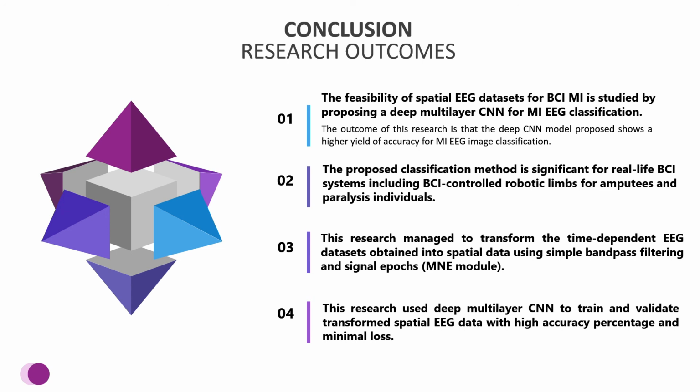paralysis individuals. This research managed to transform the time-dependent EEG datasets obtained into spatial data using simple bandpass filtering and signal epochs. This research used a deep multilayer CNN to train and validate transformed spatial EEG data with high accuracy percentage and minimal loss. That is all for my presentation.